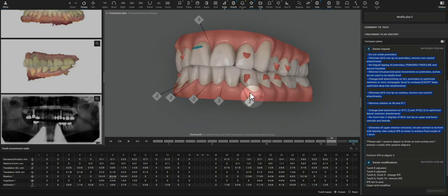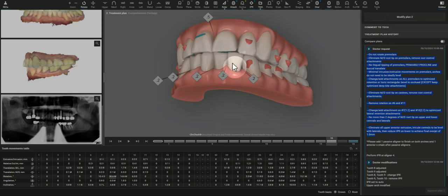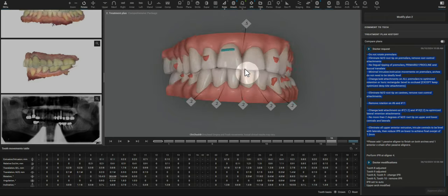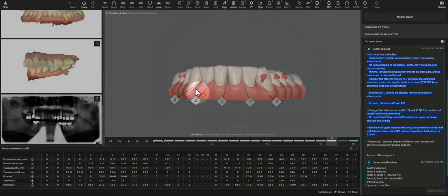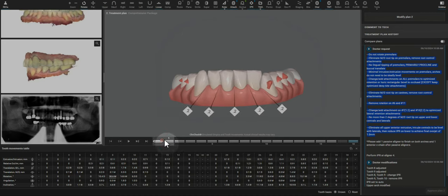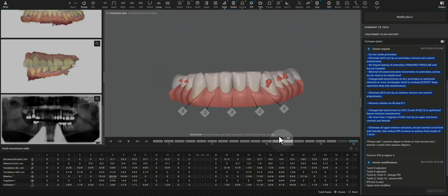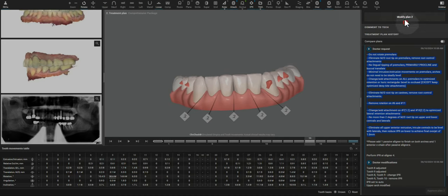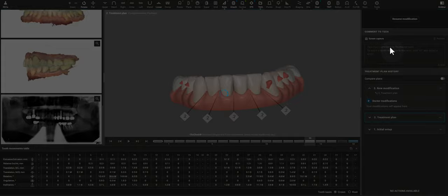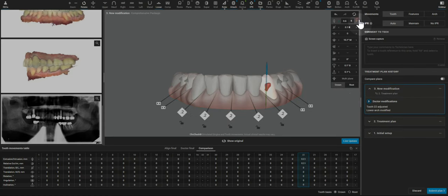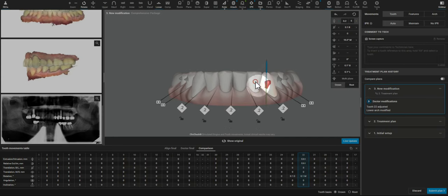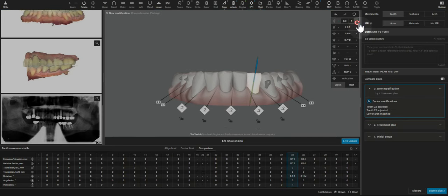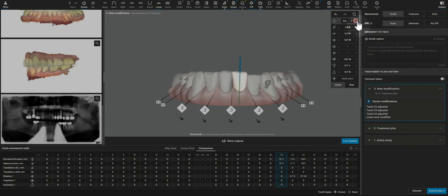To reestablish some canine guidance and protect the lower anterior teeth, I generally want to see the lower anterior teeth about a millimeter lower than the canines. So this is where I'll just go ahead and use the 3D controls to get what I'm looking for there. I'm going to take away the majority of that extrusion, and then I'm going to visually intrude these until they are far lower than the canine cusp tips.